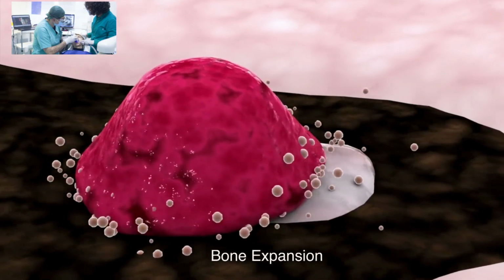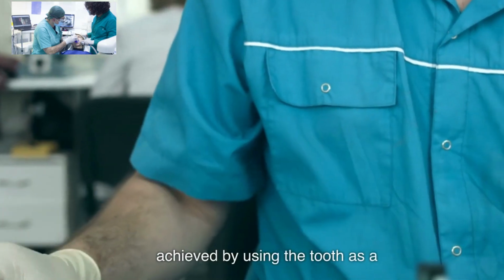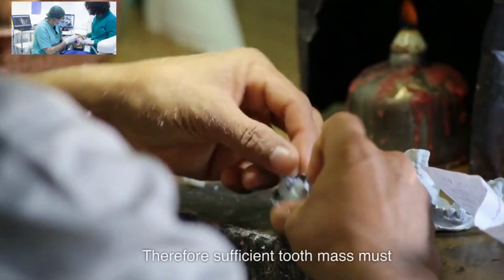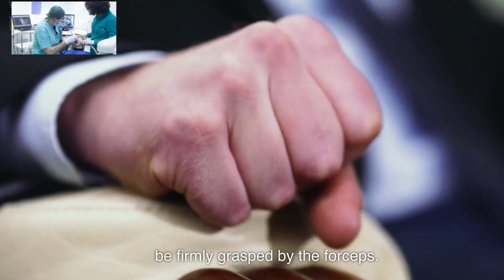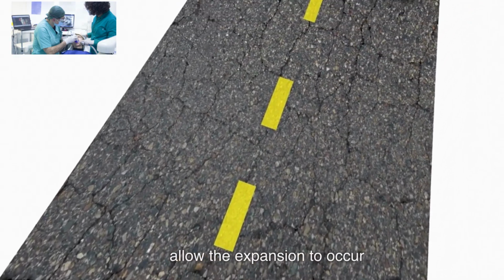Bone expansion. Expansion of the bony socket is achieved by using the tooth as a dilating instrument. Therefore, sufficient tooth mass must be firmly grasped by the forceps. The bone must be elastic enough to allow the expansion to occur.